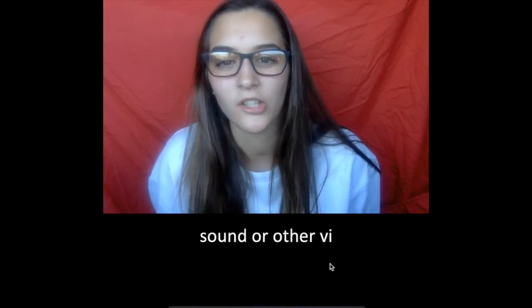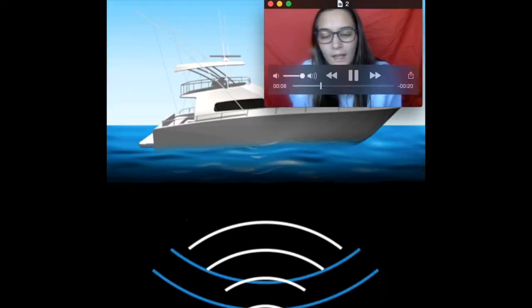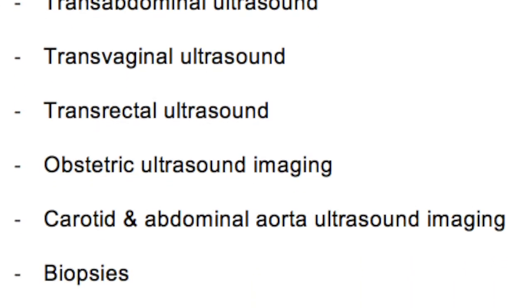So, here we go. Basically, ultrasound is sound or other vibrations having an ultrasonic frequency, particularly used in medical imaging. The principles relate to the way a sonar on a boat works, using echolocation. There are many procedures involved with ultrasound imaging, and this can include assisting with other medical procedures or resulting in diagnosis of tumours, cancers, and other abnormalities.